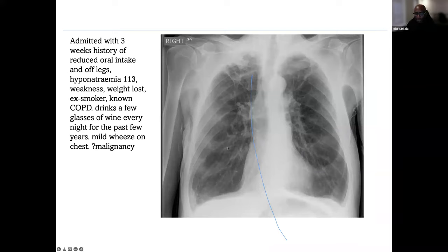We have a patient who, even without the clinical history, one would tell is a smoker. The reason is that we do have large bilateral lung volumes here with flattened hemidiaphragms, the two hyperlucent. We can see prominence of the vasculature. We can also see that the heart is quite narrow here. If I do the cardiothoracic ratio, the ratio would be far lower than the usual 0.5 here. So this is quite common in patients with pulmonary emphysema or COPD kind of thing.